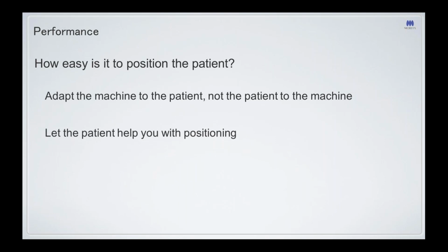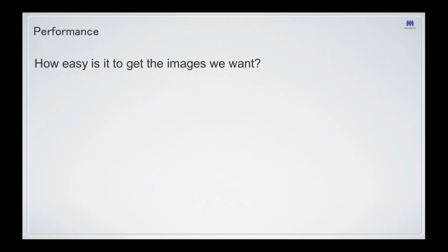And in some cases, if you can have them help you with positioning, all the better. If they can, for example, see the lines on their face, that can help orient them and make your positioning that much easier, because the patient themselves can see the lines on their face, they can see whether they're off center or not, and this just makes it easier to get them into proper alignment. And then keep in mind, how easy is it going to be to get the images you want? It's all well and good to have beautiful images on the screen, but if you can't get those images consistently, then it's going to be a problem for your staff, and it's going to be a problem for your diagnostic capabilities.